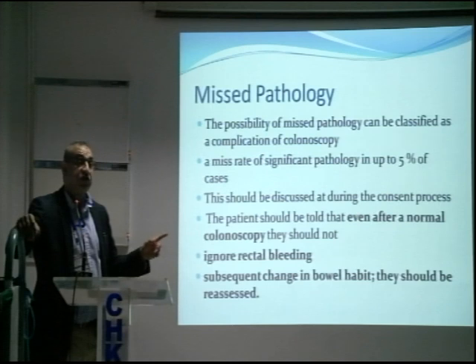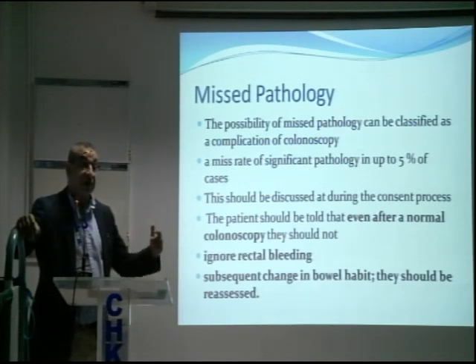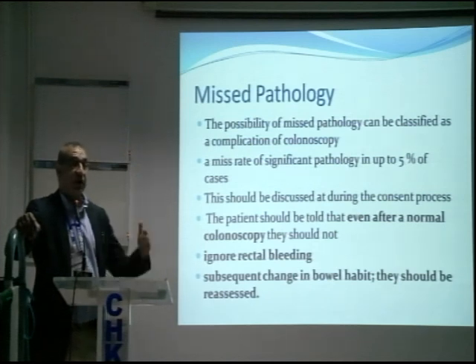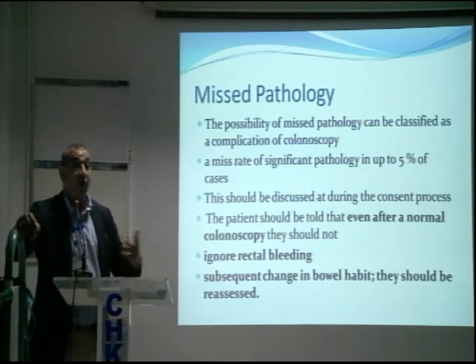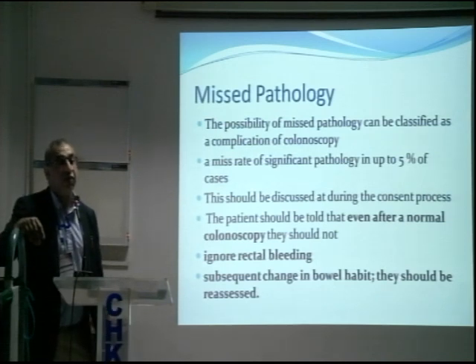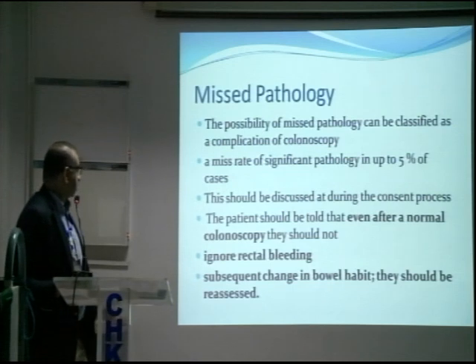And your patient should be made aware of this in their consent, that there is a possibility we might miss things. So if you've done a colonoscopy, it is perfectly normal, but the patient still has problems with rectal bleeding or change in bowel habits, they should have another procedure carried out because there's still a possibility of missing pathology, right?